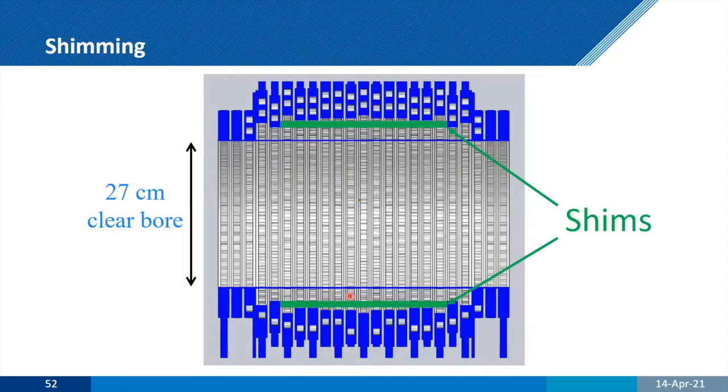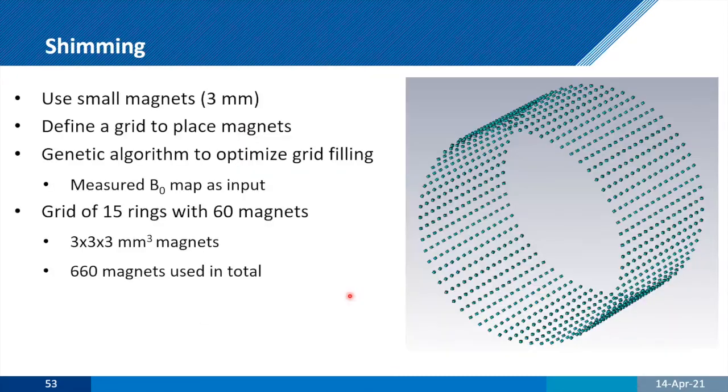So of course you can come in then and shim, and you shim the old way that people shim, which is putting in very small permanent magnets. And again, you can use the same kind of genetic algorithm to come up with the placement of those, whether they should be in one direction, another direction, or no magnet at all. And so that's another 660 magnets for Tom to put in place.